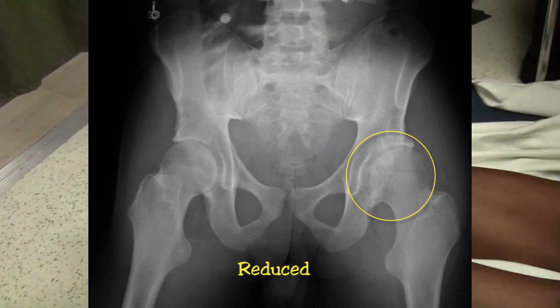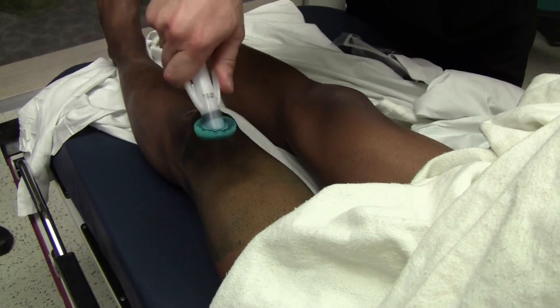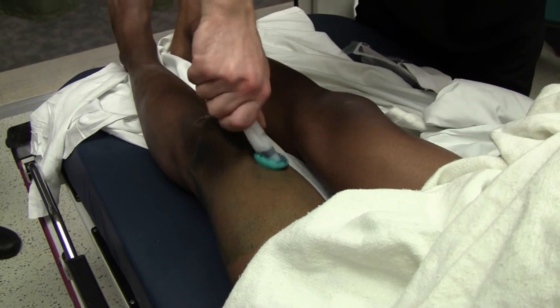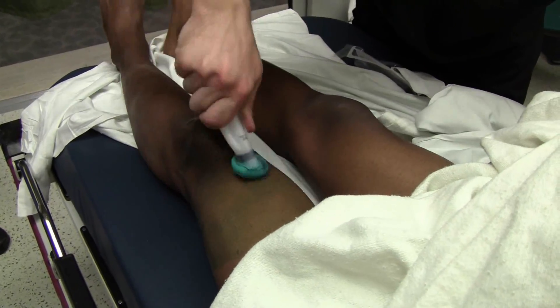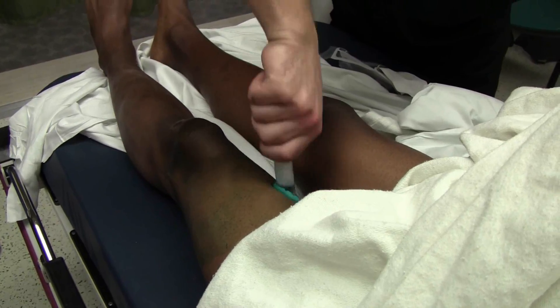Now we're going to put a femoral traction pin in to give you guys an acetabular fracture repair. Femoral traction pins always go in medial to lateral, and tibial traction pins always go lateral to medial. This will help protect the neurovascular structures.